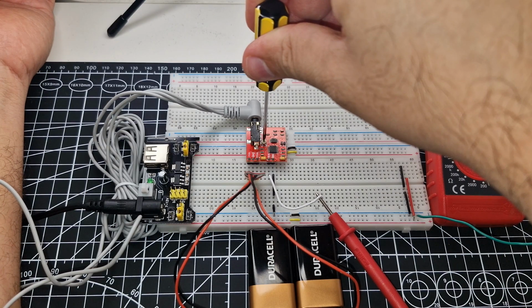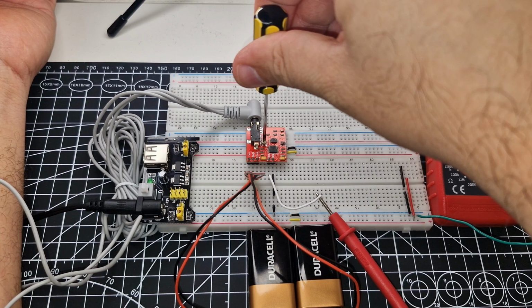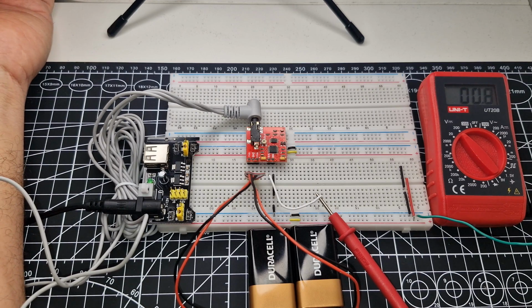Let's adjust the gain to have 1 volt, and when the sensor is stimulated, the voltage will increase. In our case, it gave us between 2.5 and 3.3 volts.